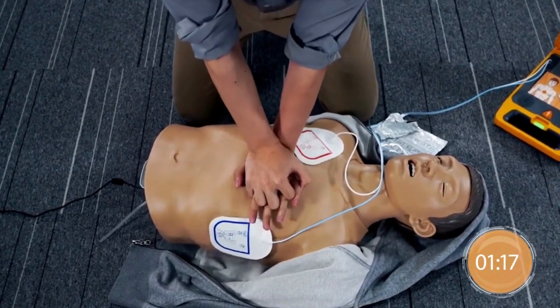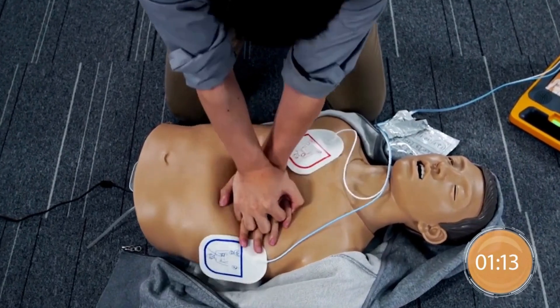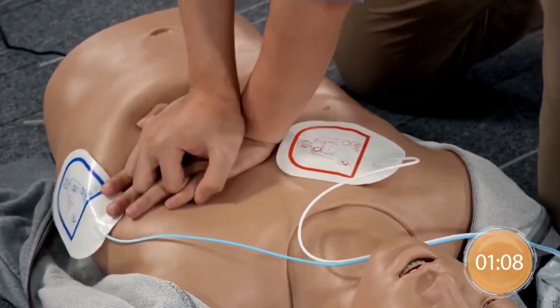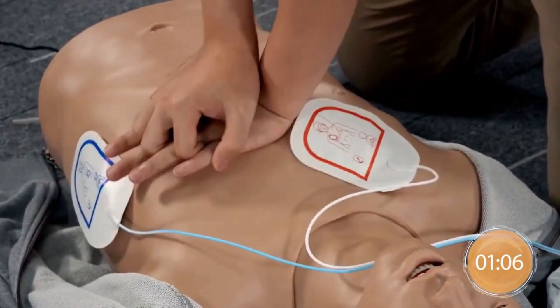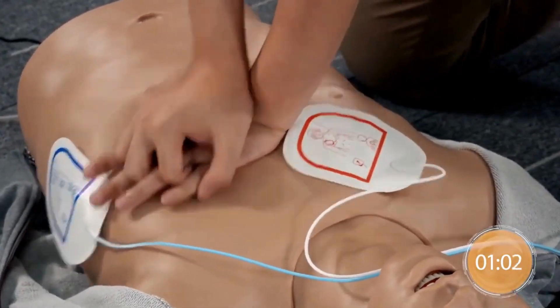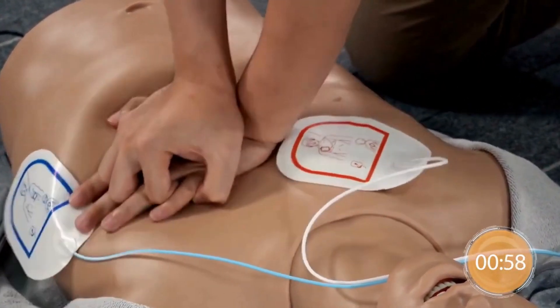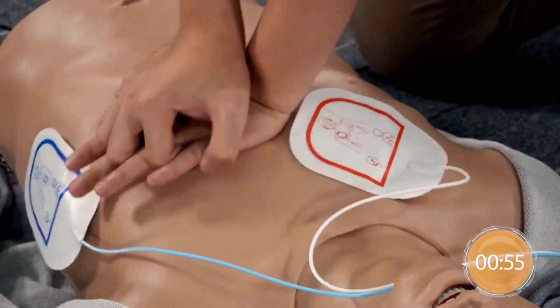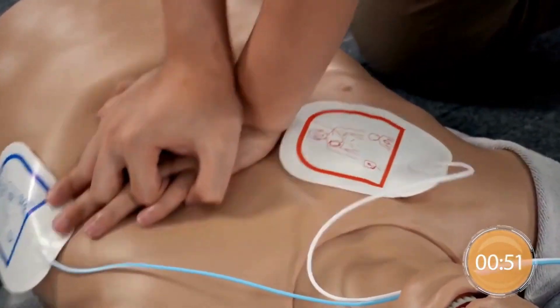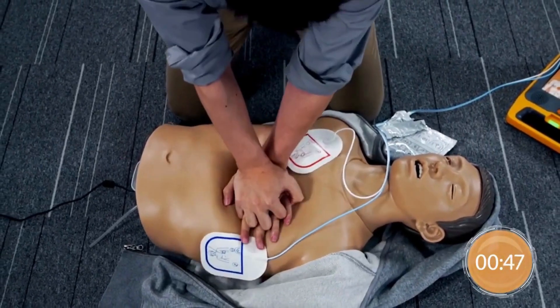Give chest compressions immediately. 100 compressions remaining. Interlock the fingers. Continue to push down hard.